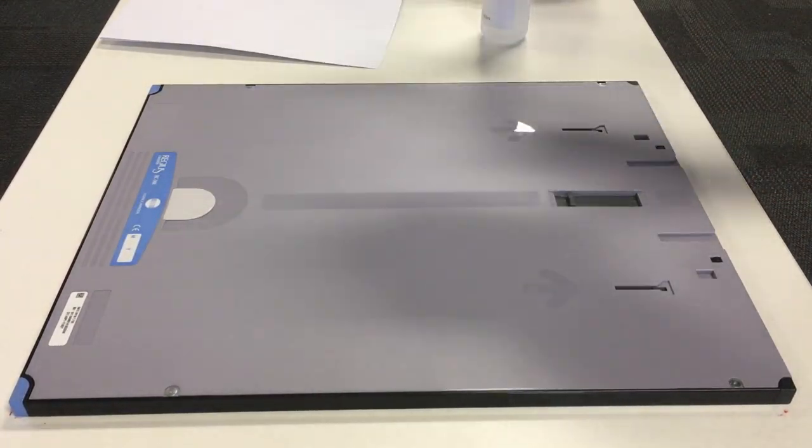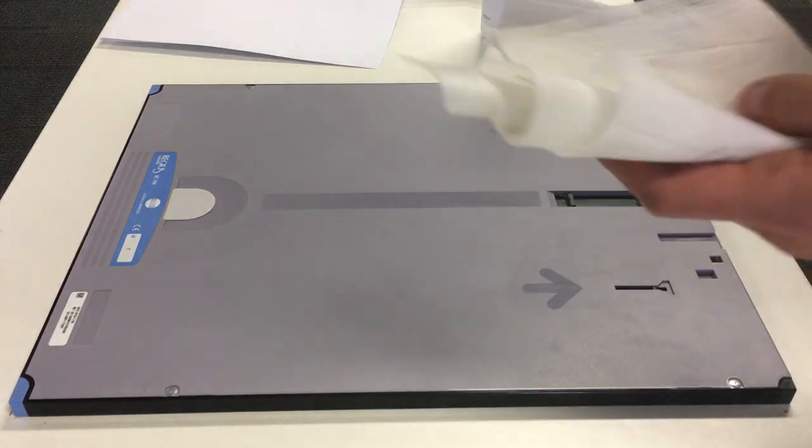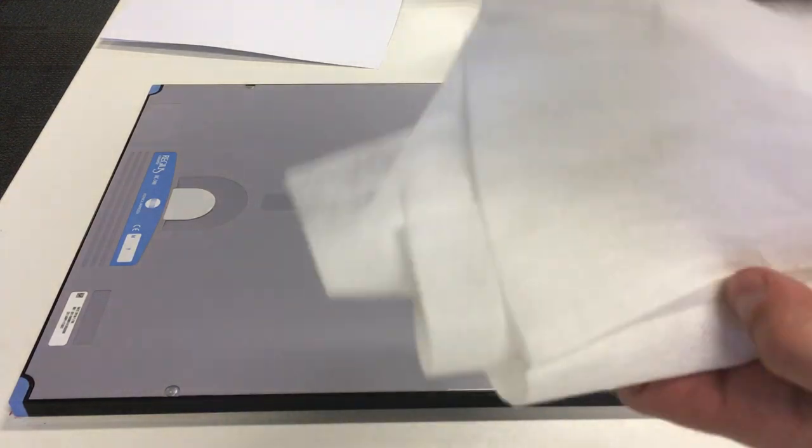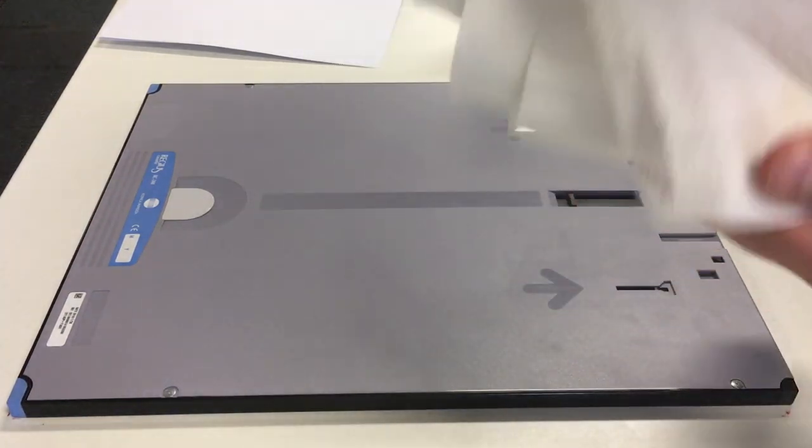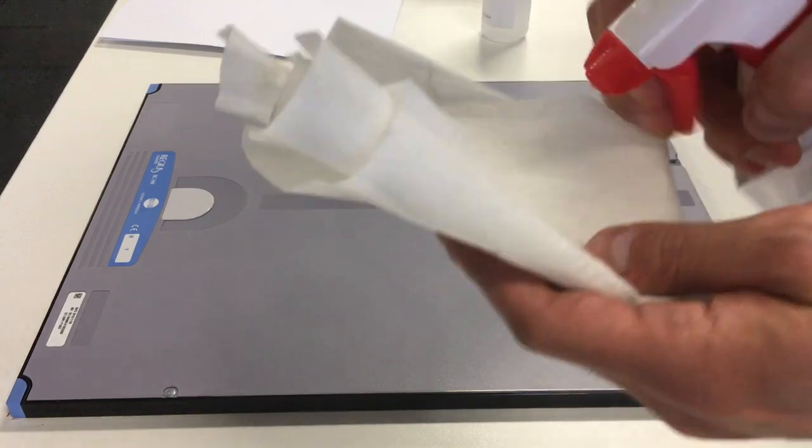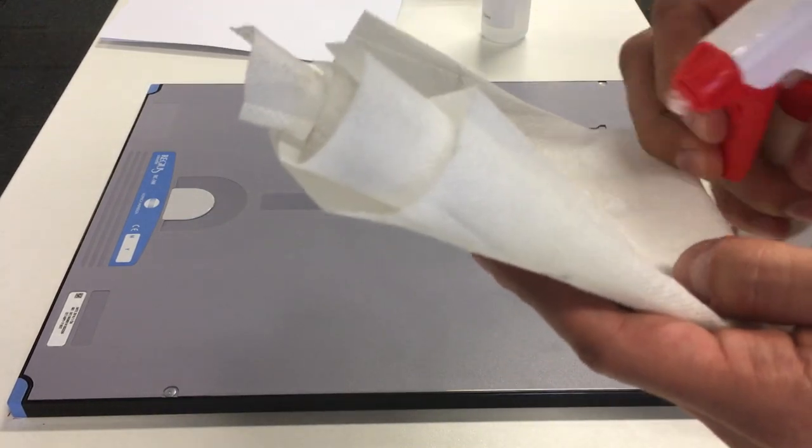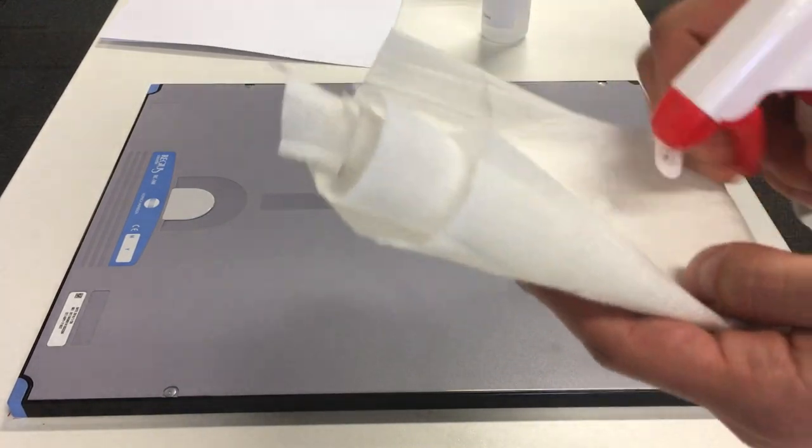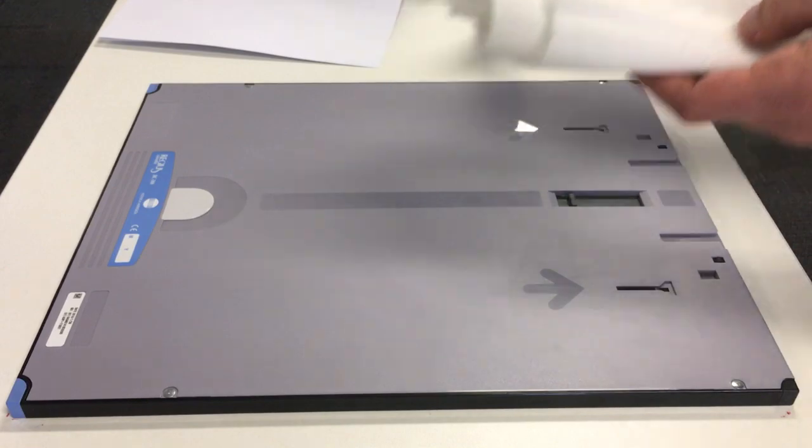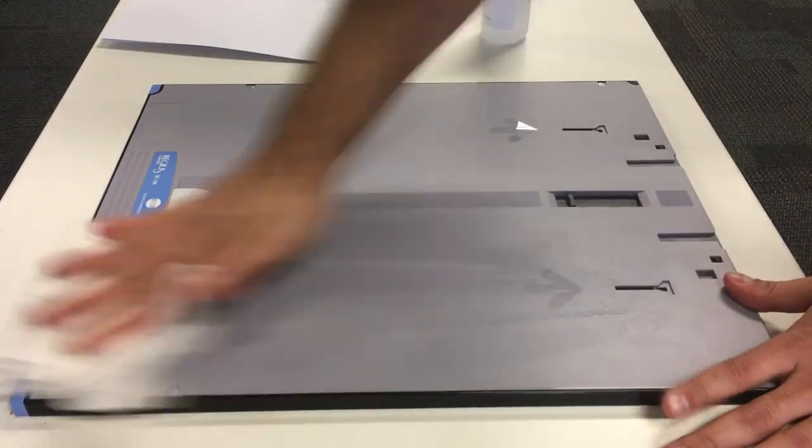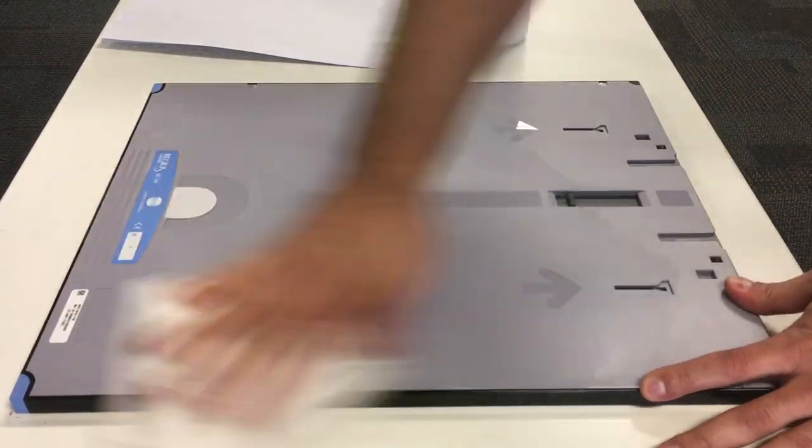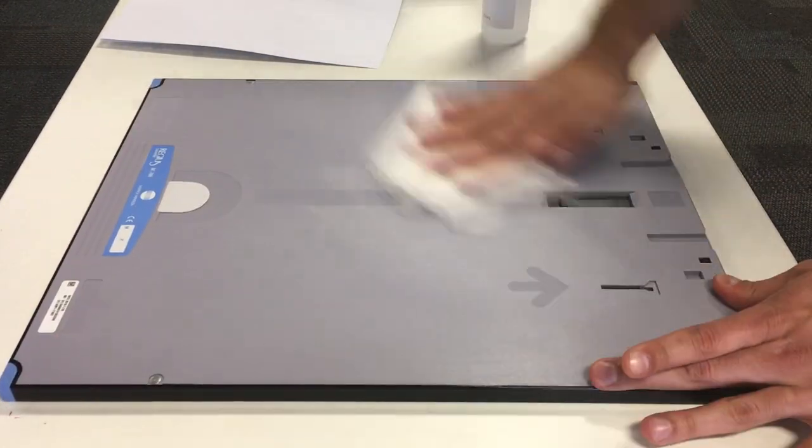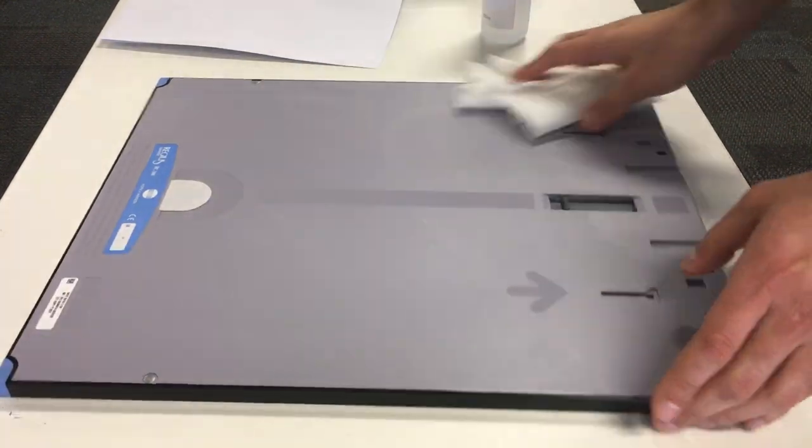So we first start by cleaning the exterior of the plate of the cassette. Just go very gently on the lint cloth and then start wiping the exterior. Make sure it's all nice and clean.